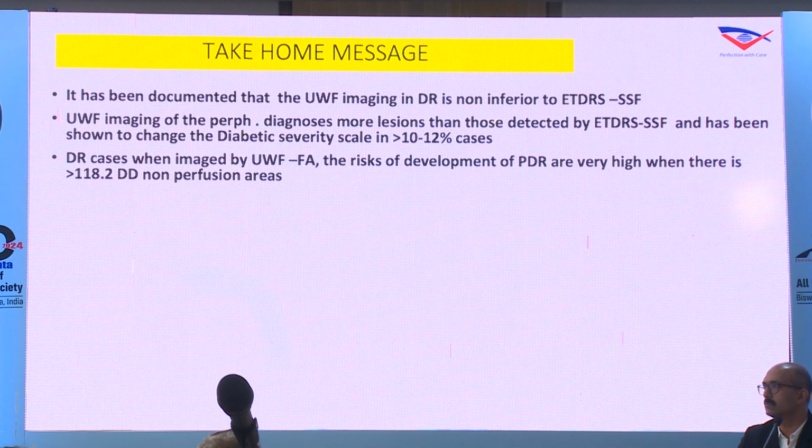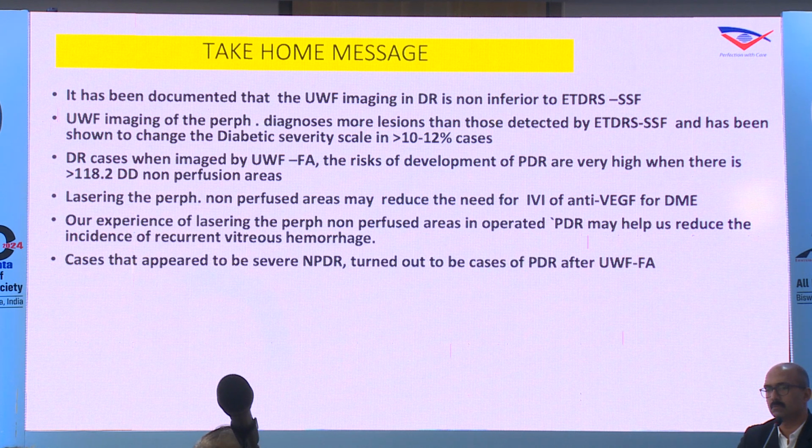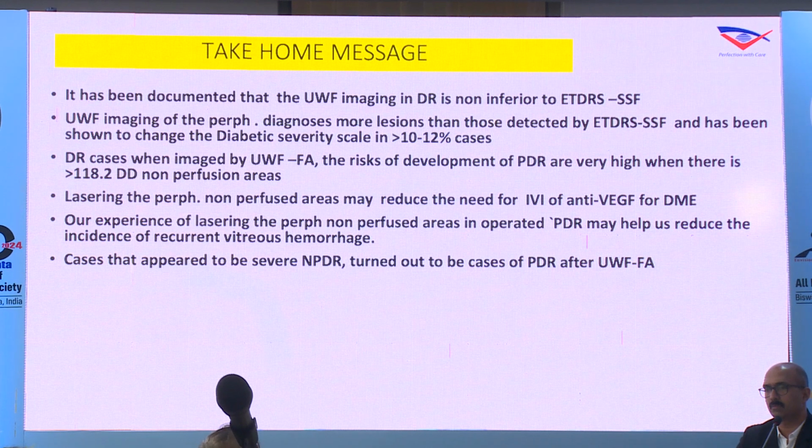So if you detect such large areas of non-perfusion, you should go ahead and laser them. Lasering the peripheral non-perfusion area may reduce the amount of anti-VEGF required in cases of DME. Our experience of lasering the peripheral non-perfusion area in cases of PDR has been very, very helpful.